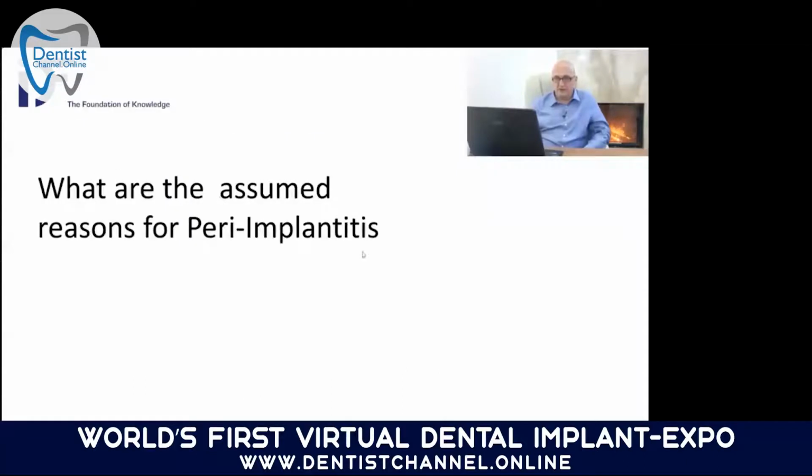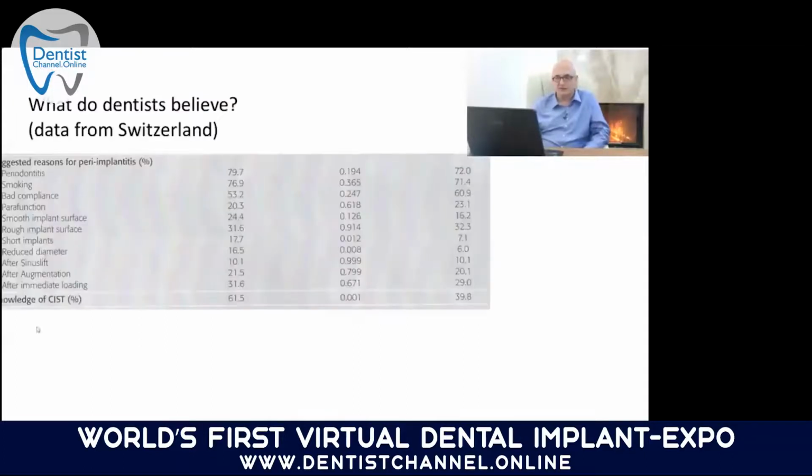So now, what are the assumed reasons for periimplantitis? A survey was published in the SSO Zeitung, the Swiss Dentist Journal. They were questioning Swiss dentists about the assumed reason, what they think, why they have periimplantitis around the implant. Now, I mean, this is not a joke. This is a true copy out of the Swiss Dentist Journal. Now, 79% said this is from periodontitis. Can you imagine? I mean, of course, there are a lot of patients who don't have teeth anymore, so where do they get it from then?